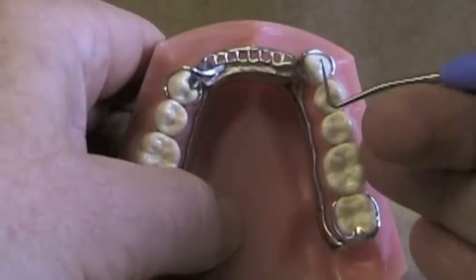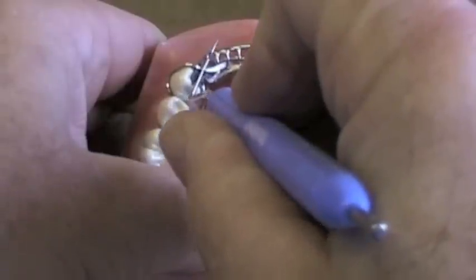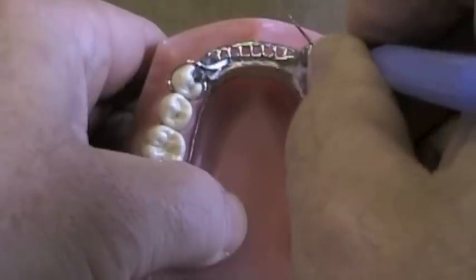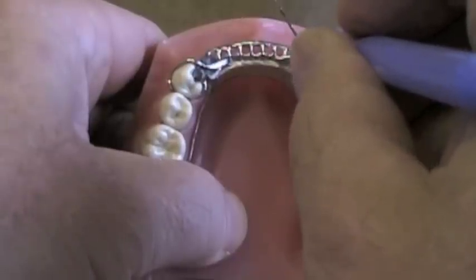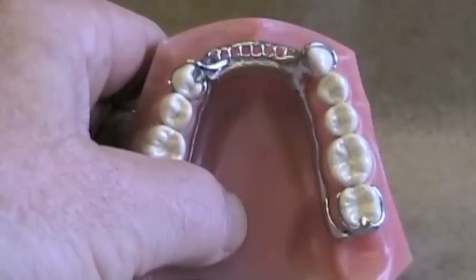Here's a case where we've got a canine on one side and a premolar on the other. The mesial guide plane on the premolar is pointing slightly forward, and the guiding plane on this canine is pointing in a different direction. They're not opposing each other directly, so they won't give as much frictional retention as the last case we saw.